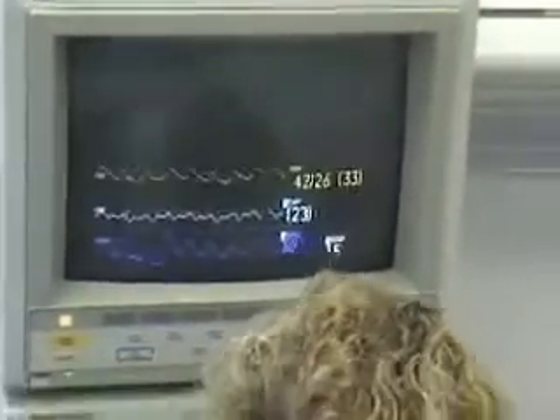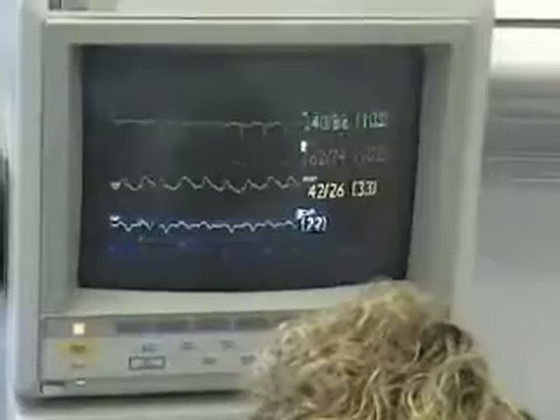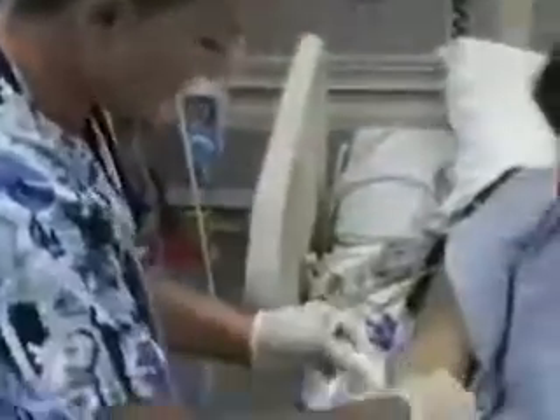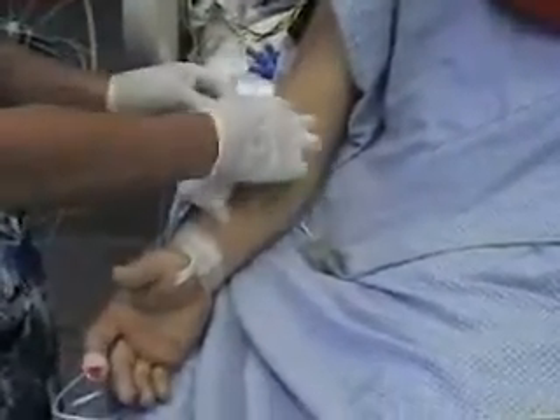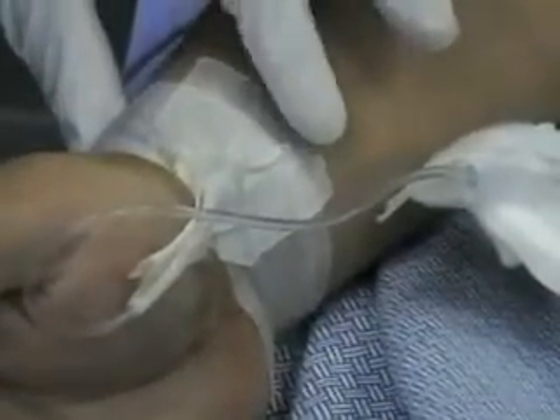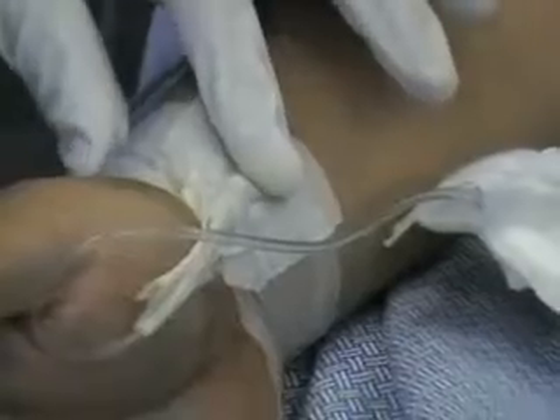Mike, we're going to pull some tape here. The art line is red and the manual cuff is green. We're taking off a little bit of tape, holding the skin down as you're pulling up on the tape. You have to be very careful pulling the art line out because it is an arterial line, so make certain that you have it secured. More often than not, you do have a suture here that is holding the art line in place, but you don't really know until you take off the dressing.